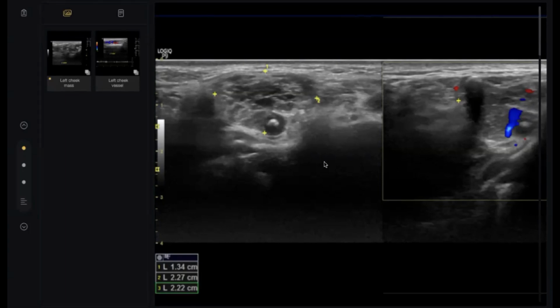Okay, thank you, doctor, so much. This is not subcutaneous. By the way, see the bone here, my colleague? This is in the deep tissue, containing flocculi and vascularity. At first I suspected that it is a phlebolith, but why is there no acoustic shadow?